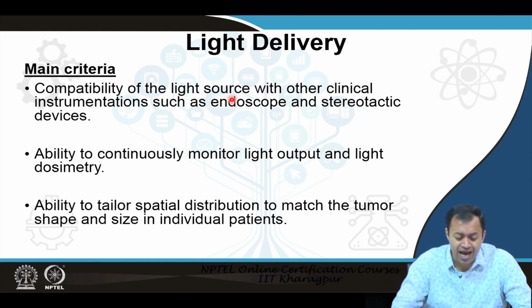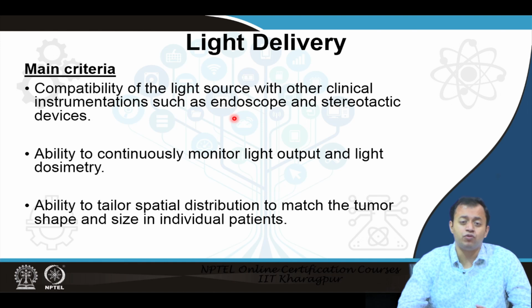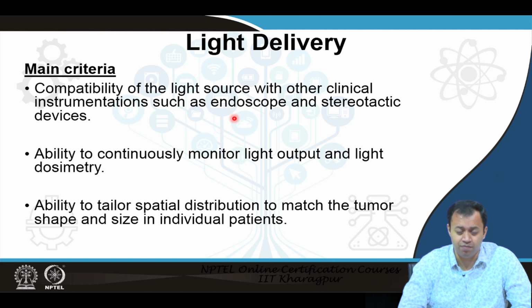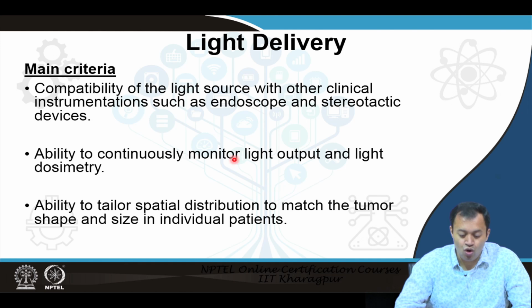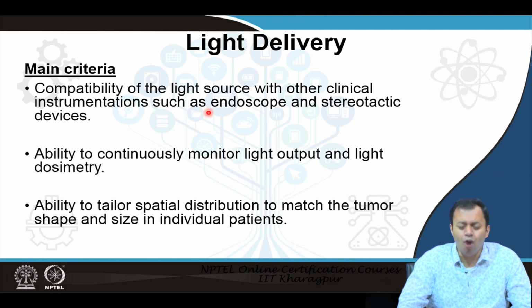So the light delivery has to be something that is compatible with other devices. That makes all of our life easy. You do not simply wait x amount of time and think that the tumor has simply reduced, has simply oxidized. We need to monitor it as well. Yes, this is the ability to continuously monitor light output and light dosimetry. This is part of the endoscope, but in a more open sense, optical biopsy.